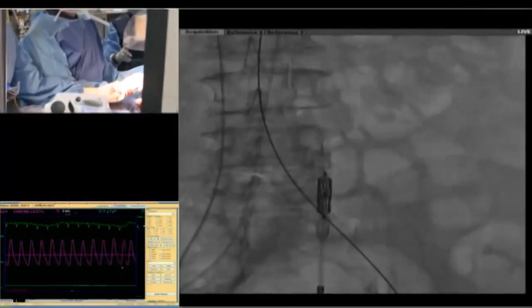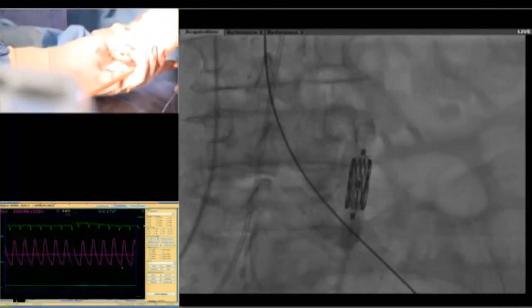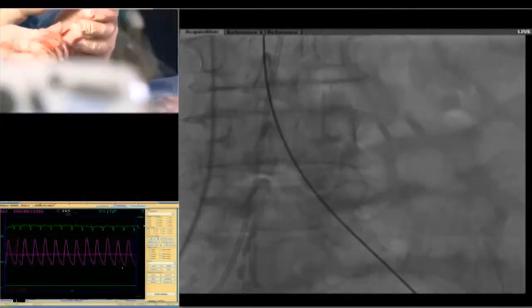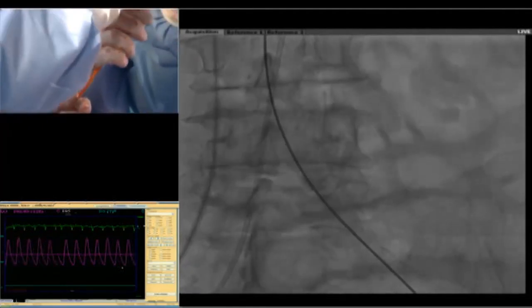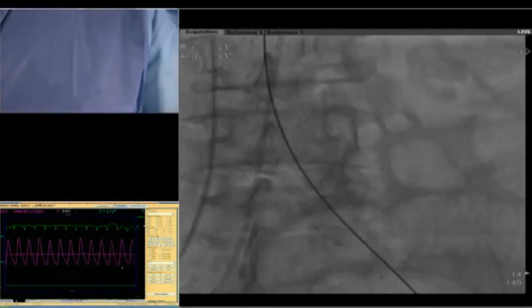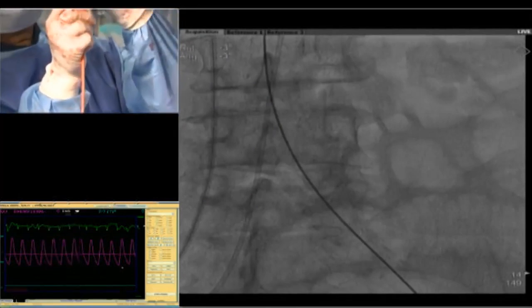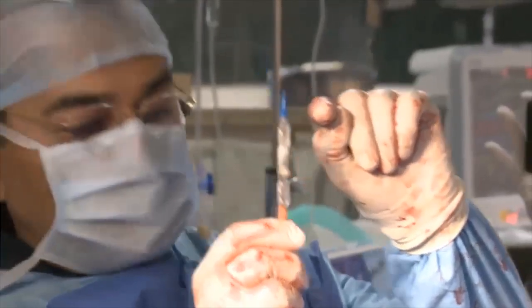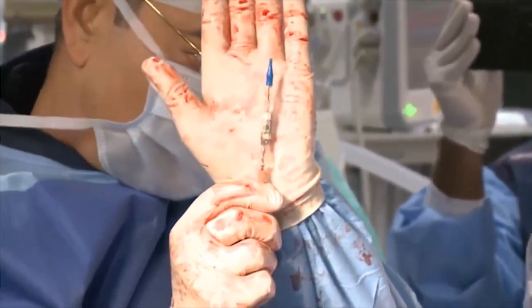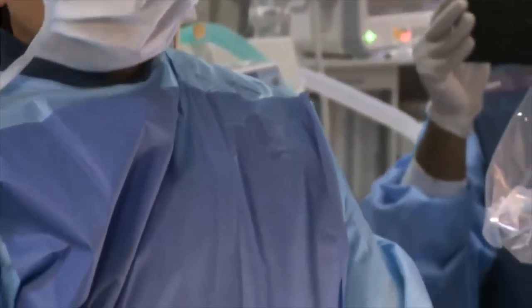Mag more. So now you can see three dots here, one right in the center and two on the ends. All right. We see that very nicely. Valve is loaded correctly. And on the external, what we confirm is this is the outer skirt. Yeah, so we can see it. It's ventricular. Right. This is something which he wanted to show. There's an outer skirt which has to be towards the ventricle. We see it very nicely. It may not be visible, but that's fine. Let's go ahead.